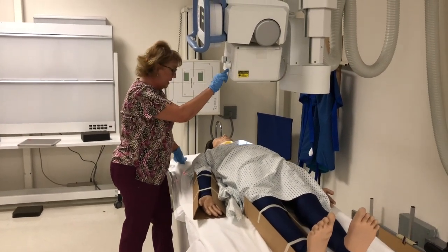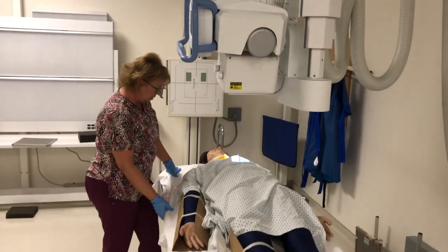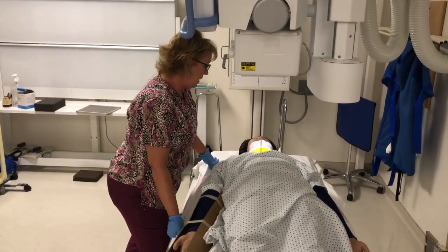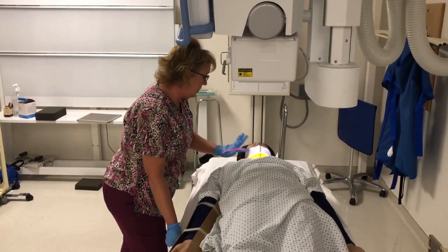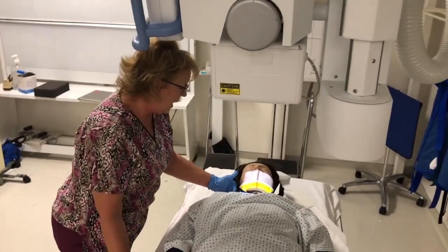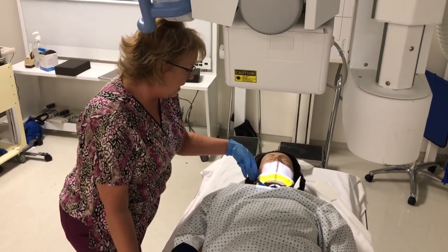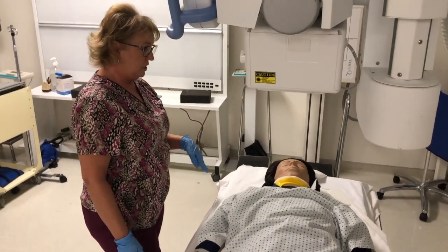All right, so she has a C-collar on, so I'm not going to be moving them at all. Not much palpation can really happen. Some C-collars have openings like this one, some don't. But you estimate where C4 is, and you can kind of gauge the top of the C-spine by the bottom of the ear. So I would take a projection like that.